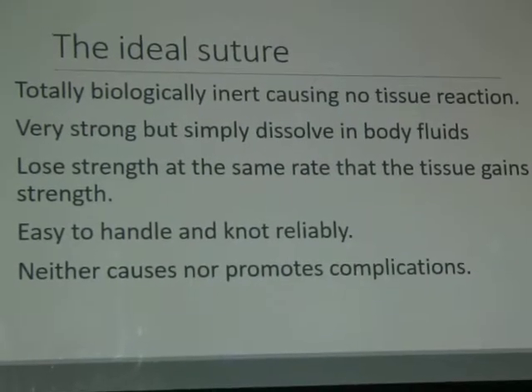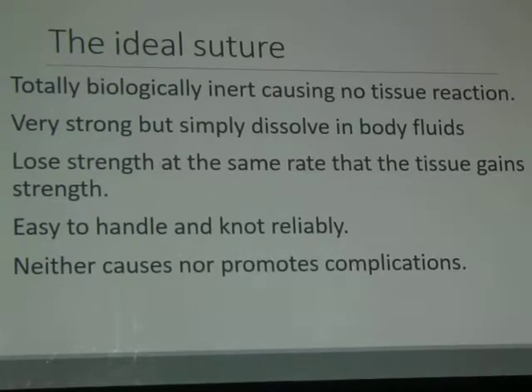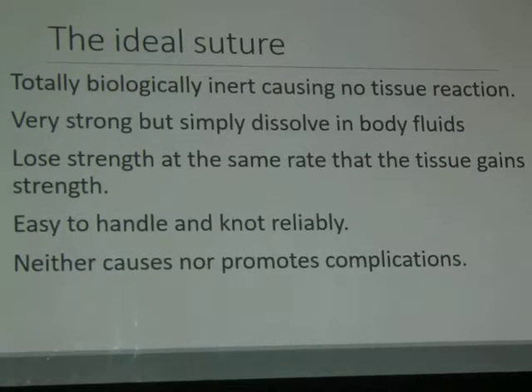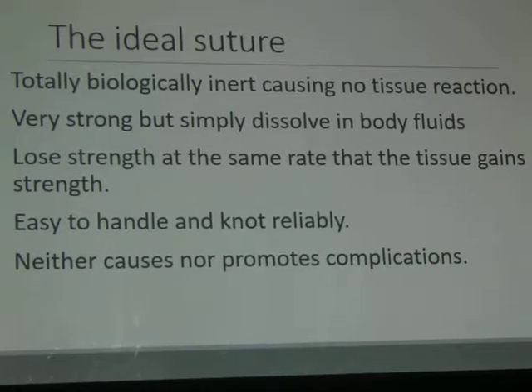لو الجرح بتاعي مش نظيف، لو الديزاين of the wound is not proper, whatever sutures we are going to use, the wound will disrupt. فدي حاجة أساسية إن الخيط helps the normal healing.